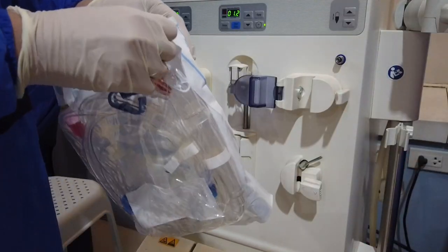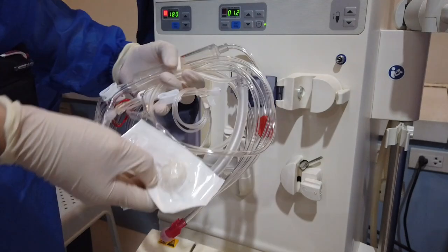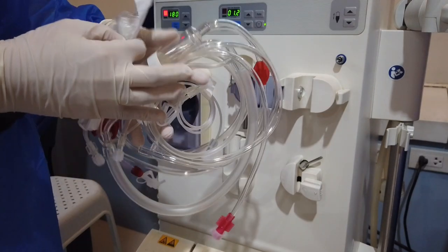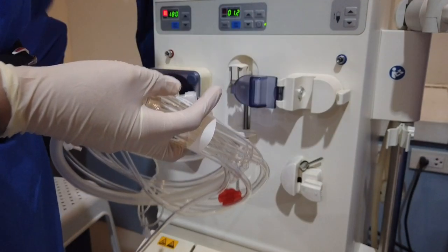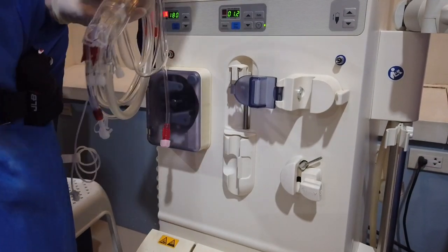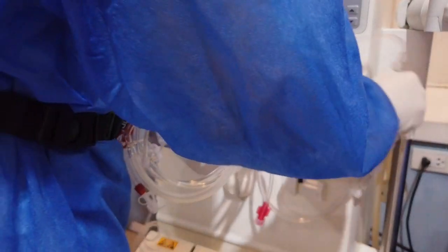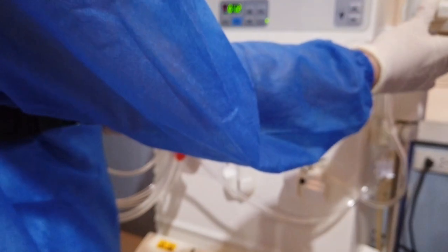Let's start. First, unpack the bloodlines. It consists of a venous line that comes with a drainage bag, a sealed transducer protector, an arterial line, the infusion line, and an extra recirculating connector. Let's start with the arterial line first. Place it on the arterial chamber holder in a reverse position for ease in expelling air, and close the surrounding small clamps. Locate the dialyzer end and place it on the side of the dialyzer clamp holder.